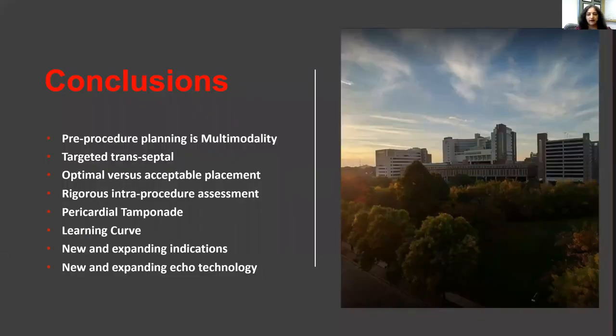In conclusion, interventional echo is a growing field. You can expect to see more and more questions on echo boards as these technologies mature. For you in the field of interventional cardiology, I'll just leave you with these key points. Pre-procedure planning is critical, and it is often multimodality. A target transseptal can either make or break the procedure. What I've learned is the difference between optimal versus acceptable placement, really tailored not only to the device, but also to the patient and their comorbidities.